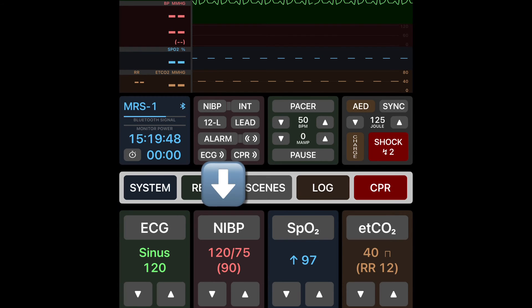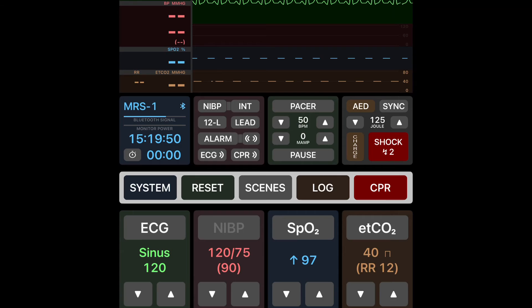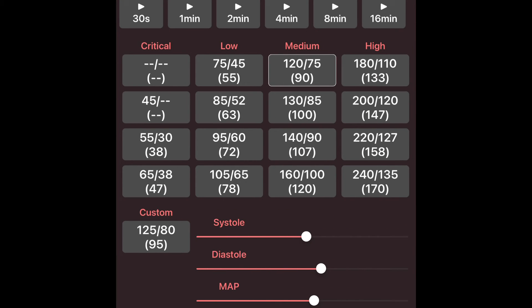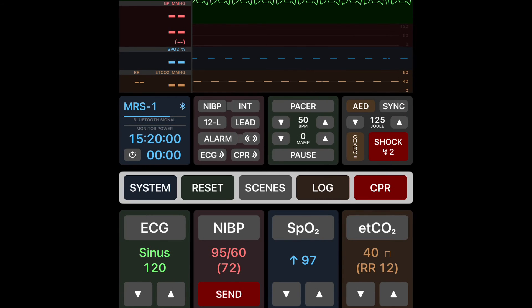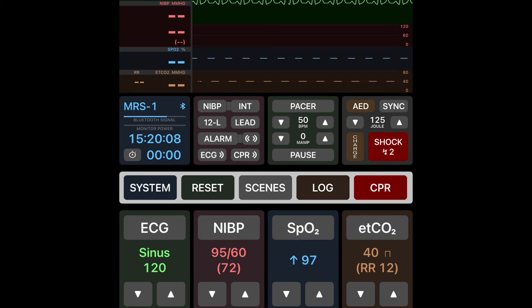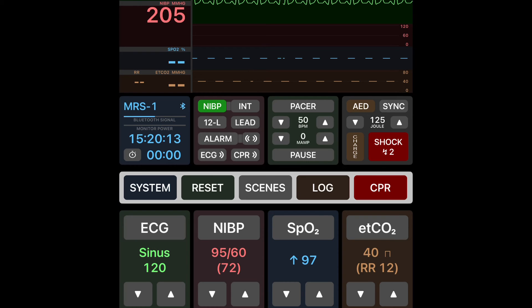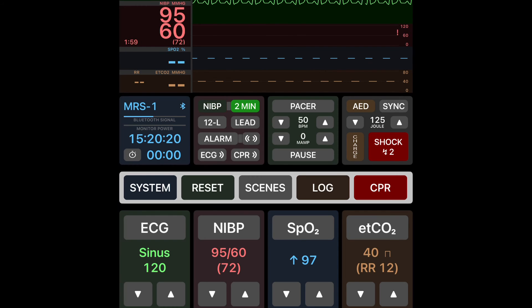Next let's look at the blood pressure section. To change the blood pressure, press the NIBP button. You can select from one of four columns with a quick button or move the bottom toggles and select custom to create your own blood pressure. Once your choice is selected, at the main screen press send and press the bottom NIBP button. This button must be green for the student's display to update. Once this is done, the next blood pressure the student sees after pushing NIBP will be your custom blood pressure.